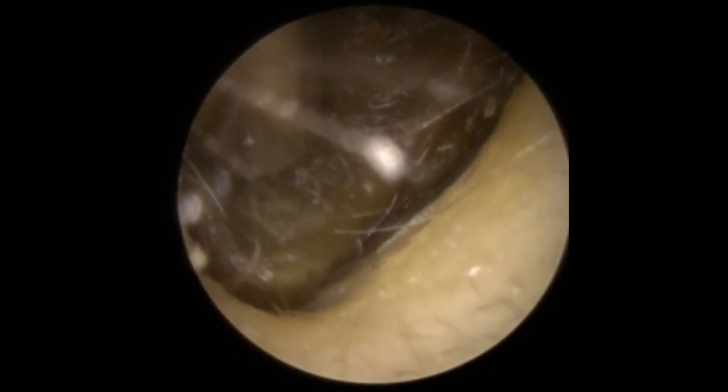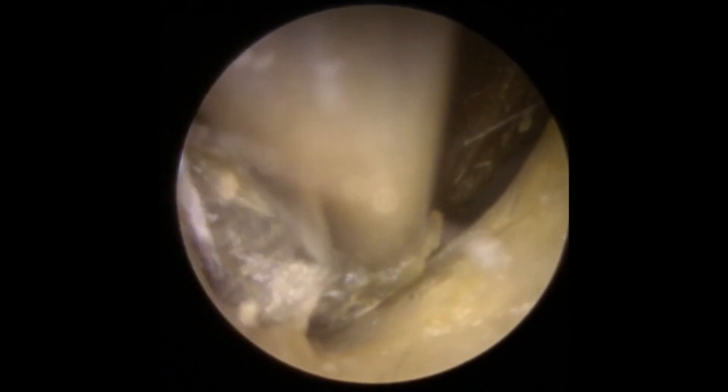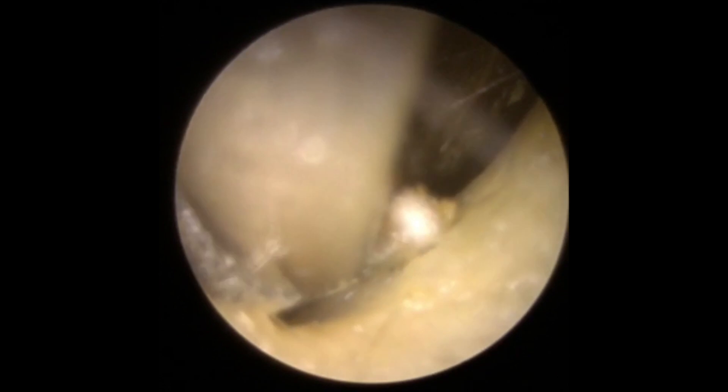The second patient in the compilation has some very dry, older-looking earwax, really quite firmly attached to the canal wall. We're going to use the standard size Zolna tube here just to test it first, get a little bit of grip on the outside edge. If we can detach it from the canal wall on this side, we may be able to get it in one big chunk. There's a little bit of dry skin underneath as well which is going to complicate things, because it's going to hold on to that dry skin, and it's just not really budging very well. We'll try to get a grip on the central section, but not getting a good enough grip there, so we're going to go back down to the bottom.